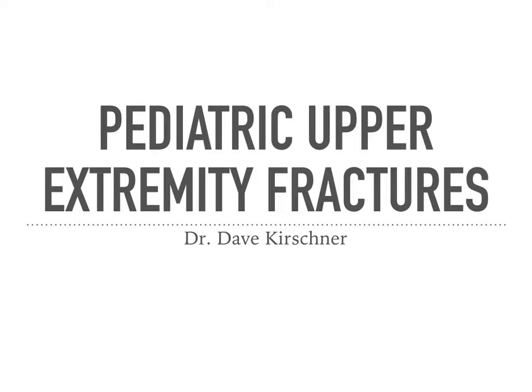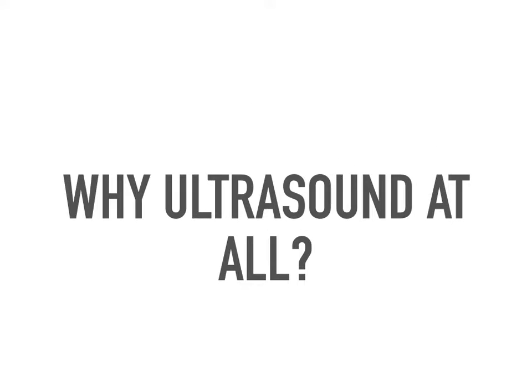of fractures. We will not be covering Salter-Harris fractures, as imaging fractures at growth plates is very difficult, and studies have shown we are not good at picking them up in those locations. But why ultrasound fractures at all if we can get definitive imaging?